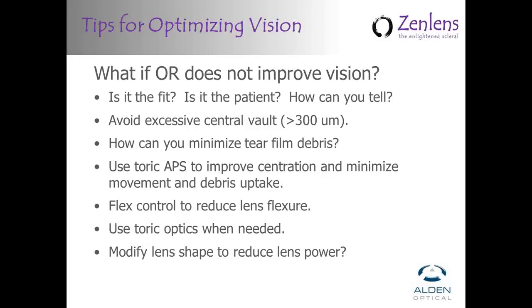even in the absence of lens flexure. So these are some of the things, and I don't know if Dr. Judlicka, is there anything, any tips that you have if you have a situation sometimes where doctors will say, the patient's just not getting as good a vision as I had anticipated, and I'm not getting any lens flexure. What else is there maybe that you might consider?